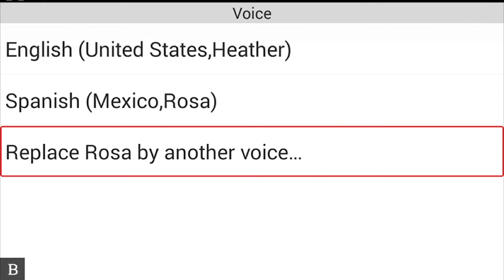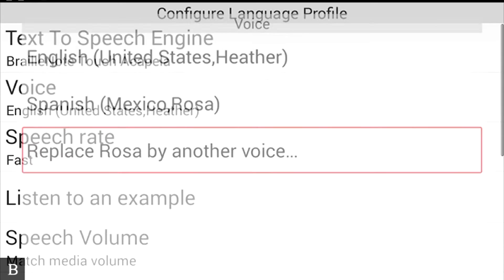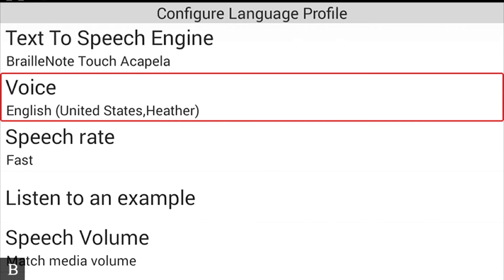At the current time, the BrailleNote Touch is localized only in English, meaning the menus are all English. However, if you speak two languages and access websites or documents in other languages, there's nothing stopping you from using any of the pre-installed languages for Braille tables and text-to-speech. Back in 'Configure Primary Language Profile,' the primary language is the one you'll be using the majority of the time.